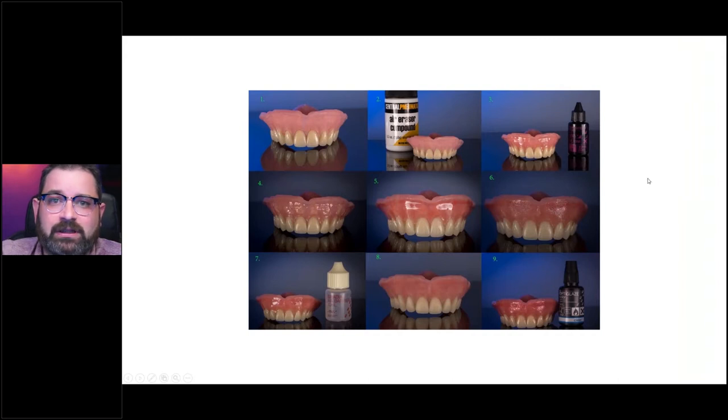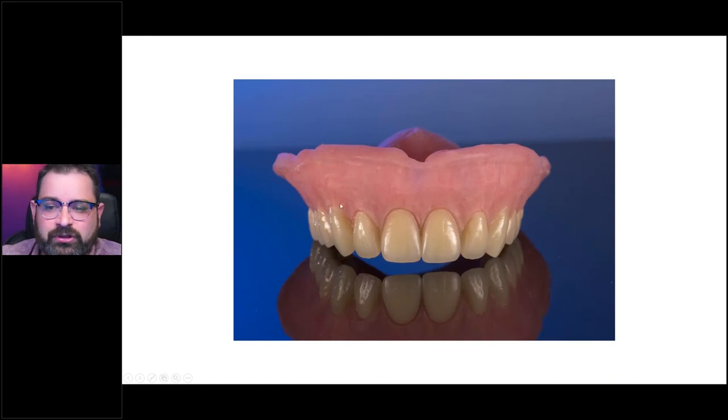So let's take a look here. I've listed and showed all the steps that we're doing for this particular case. Now, this case was an analog case, but don't be discouraged — it's pretty much the same process. If you see right here, the reduction was done with a burr, and you can see the burr marks.